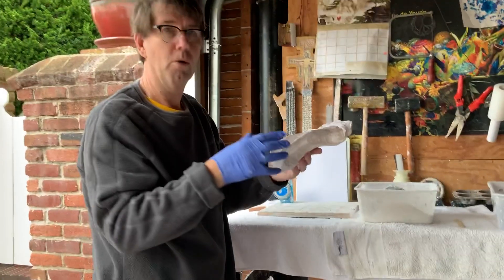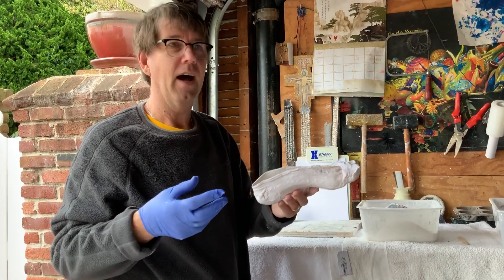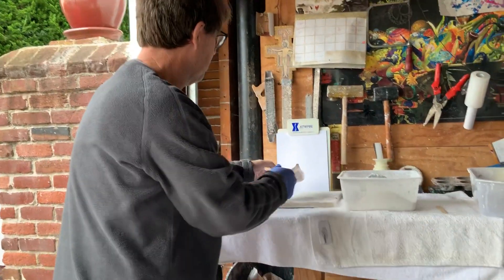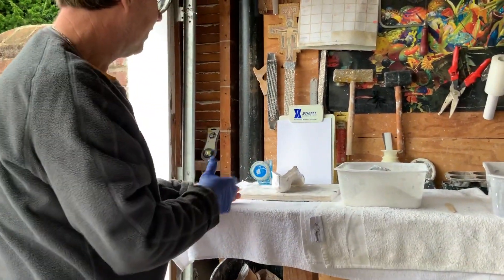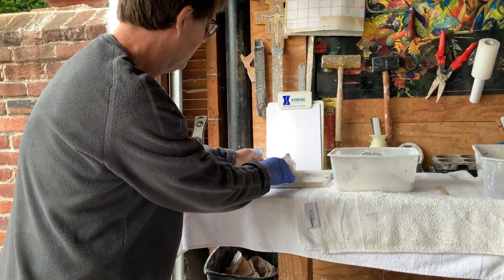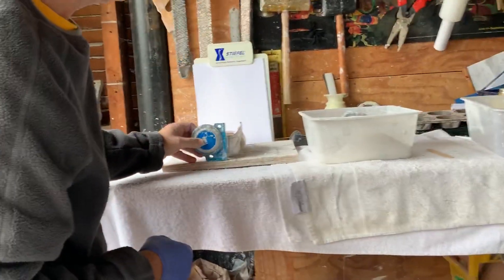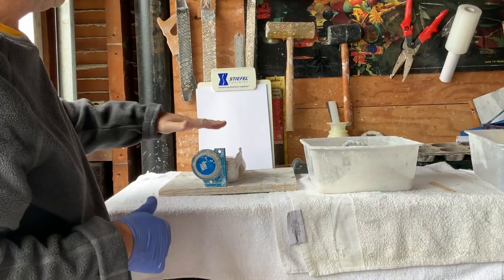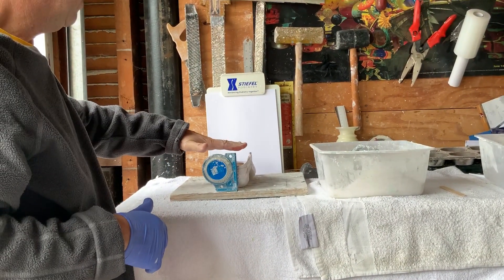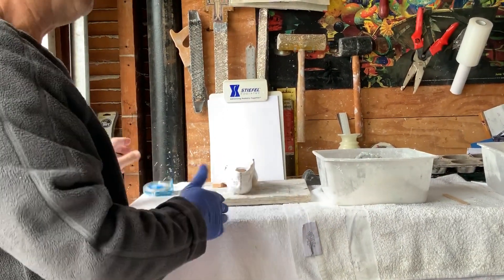Now we're going to pour plaster of Paris powder and make a positive cast. We're going to set up the negative cast. We've bisected our heel and we're going to center it so that the heel is straight up and down. That's really crucial when we make the orthotic — our new reference point is going to be the top of the cast, which will symbolize where the ground is at vertical.